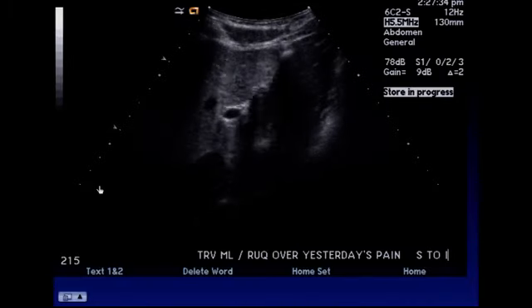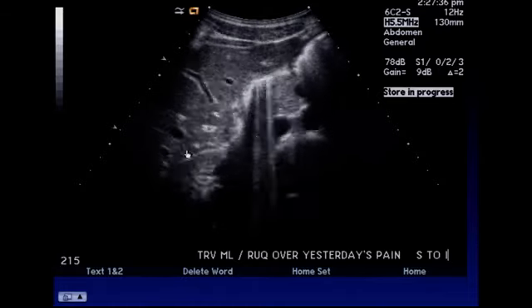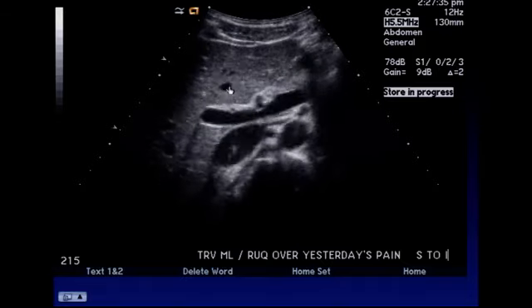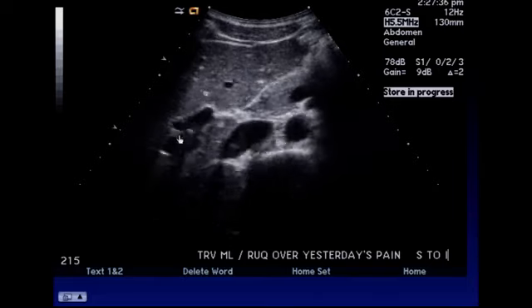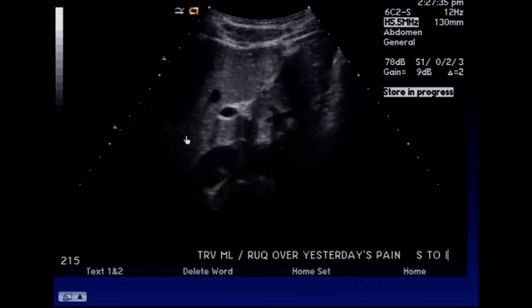But then when we look at the ultrasound, and here's a clip passing through, starting up at the junction of right and left lobes, porta hepatis, and then going down into segments 5 and 6, we really made no observations here. But in retrospect, if you look at the periportal triads, particularly down here in segments 5 and 6, you can see that they are very echogenic. So this is, again, that periportal so-called edema, starry sky liver.